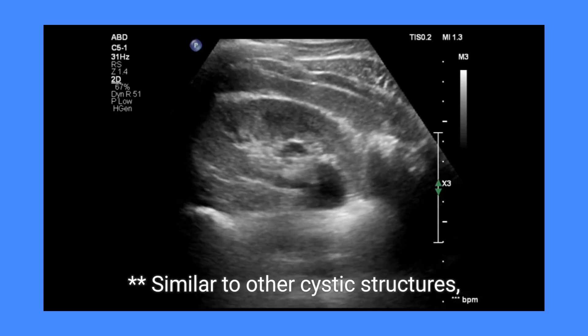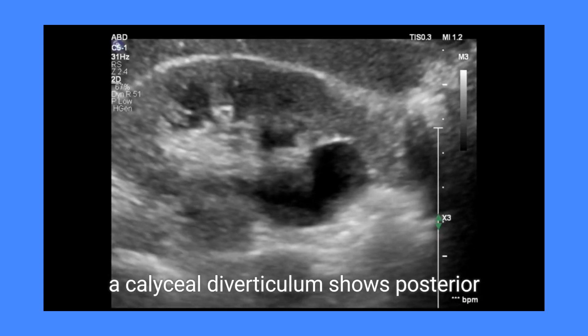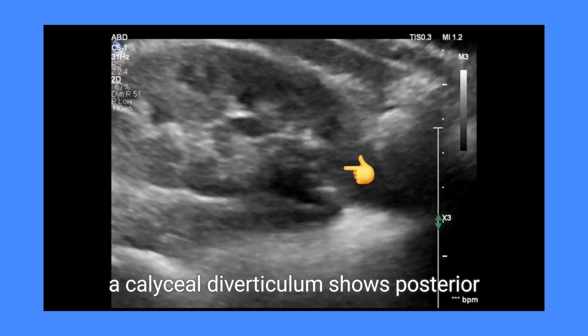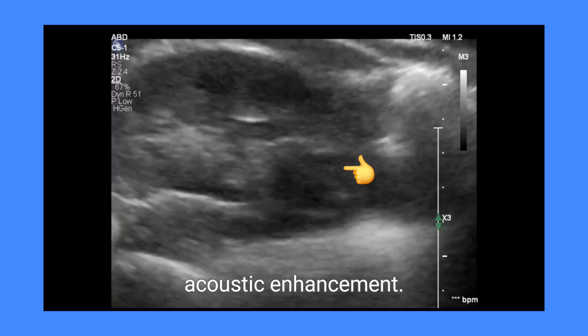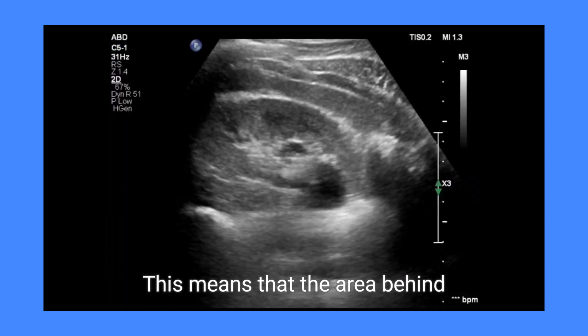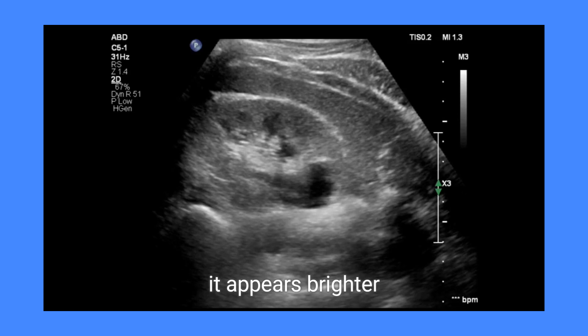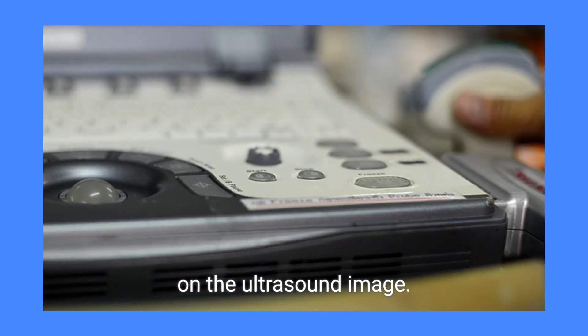Similar to other cystic structures, a calyceal diverticulum shows posterior acoustic enhancement. This means that the area behind it appears brighter on the ultrasound image.